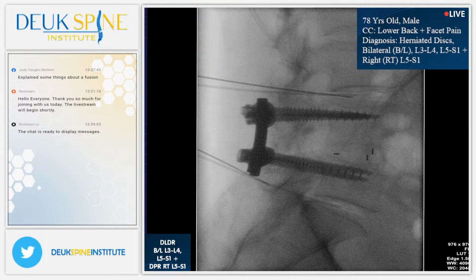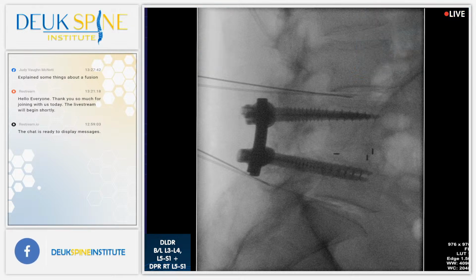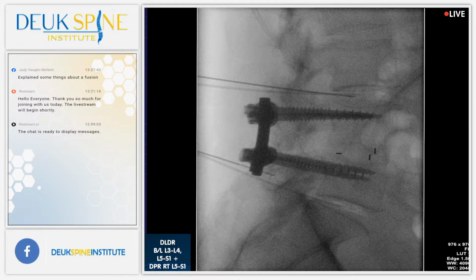Let's see if I can find a way. The good news is if I can't do it on this side, I've got the other side. Ooh, I might have something.